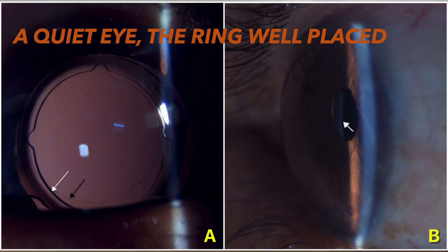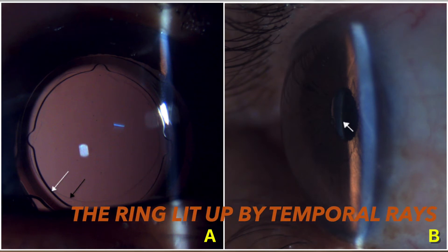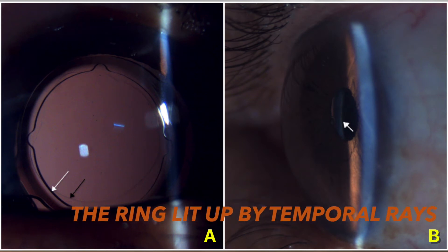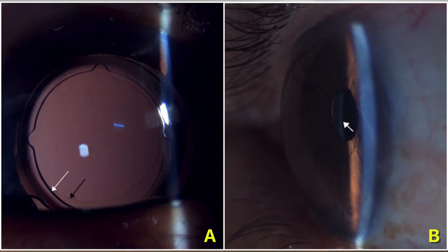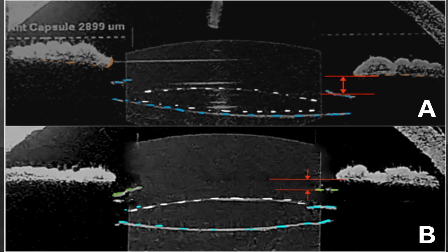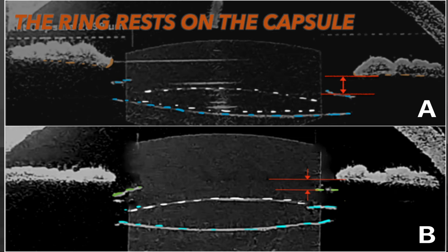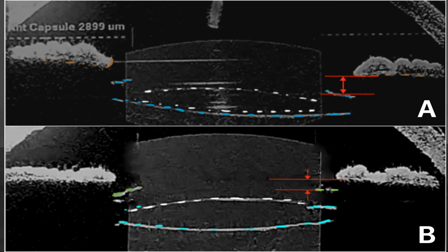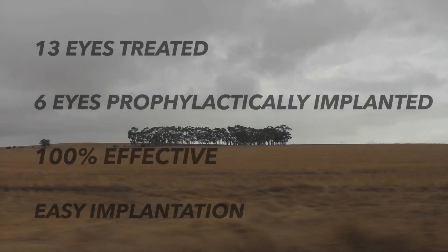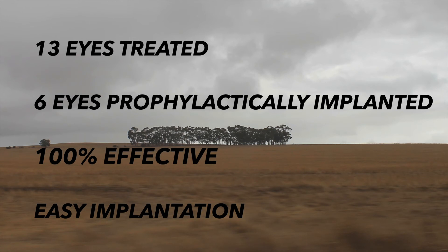The ring appeared to cover the peripheral anterior capsule 360 degrees. A temporal peripheral slit beam passing through the undilated pupil is incident on the ring. Anterior segment OCT shows that the ring, which has a thickness of 250 microns, sits comfortably on the anterior capsule, leaving some space between the iris and the ring. In a pilot study including 13 eyes in the therapeutic group and 6 eyes in the prophylactic group, this device was found 100% effective, safe, and easy to implant.